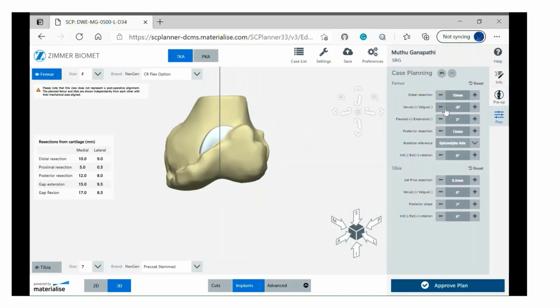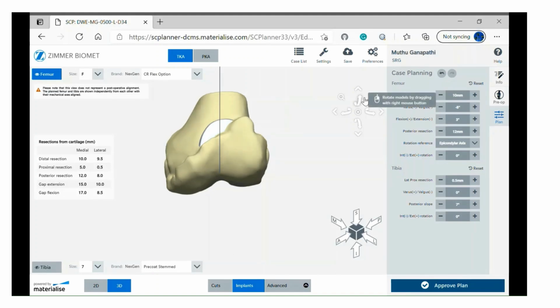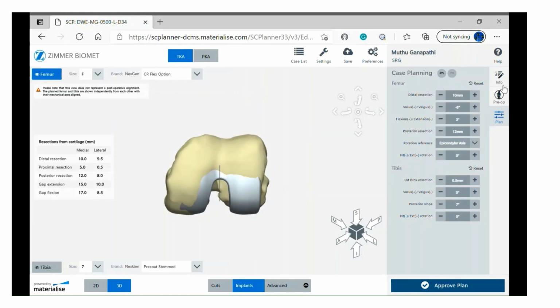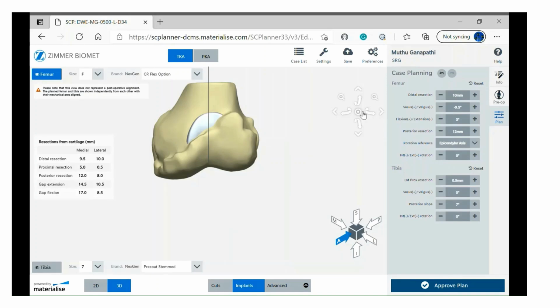So now I can look at distally. A little bit of metal still there, so I can add more valgus. So we're almost there. Now if you look at the valgus side, it's about 9.5 degrees compared to neutral mechanical axis. So obviously that's quite a lot. So the question is, what was the pre-arthritic anatomy?